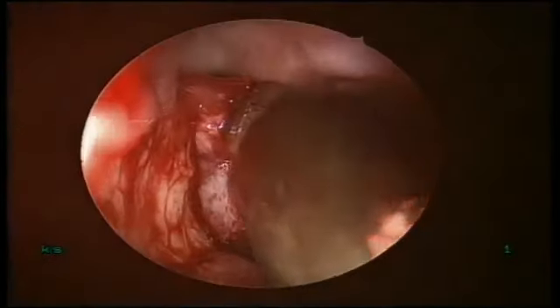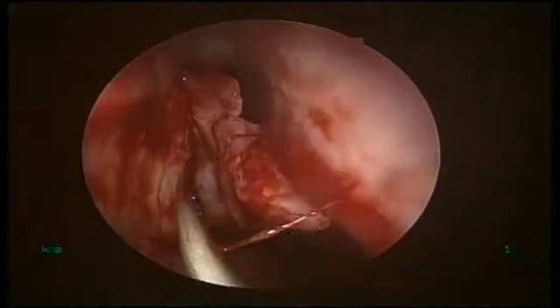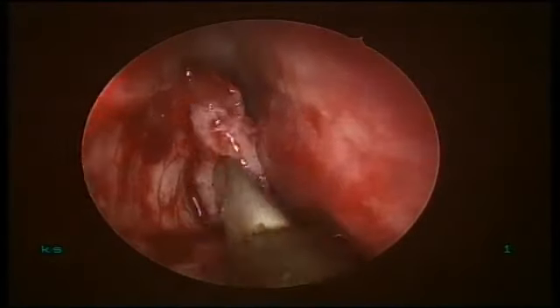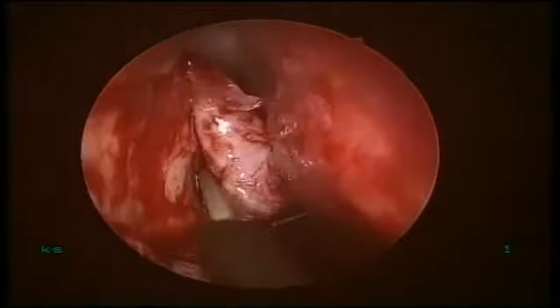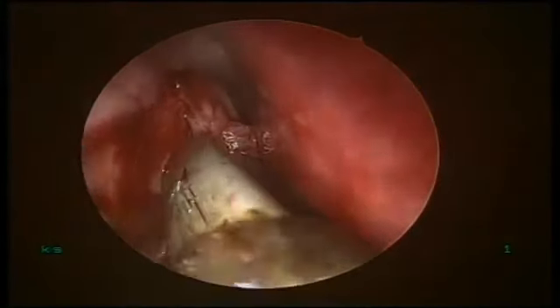How is the picture there? Okay, I will evert this flap like this and push it medial to the middle turbinate.